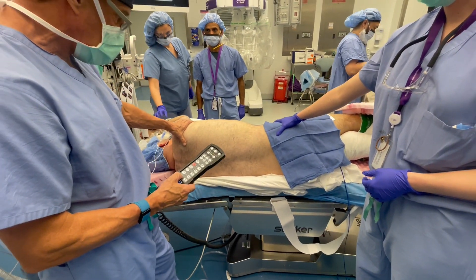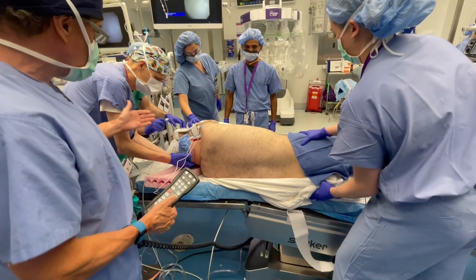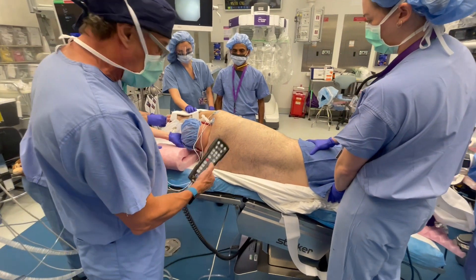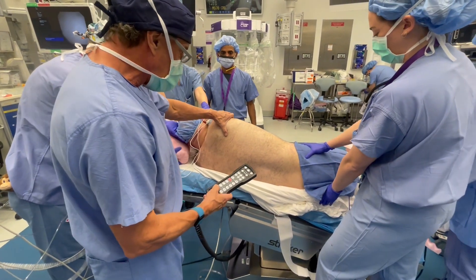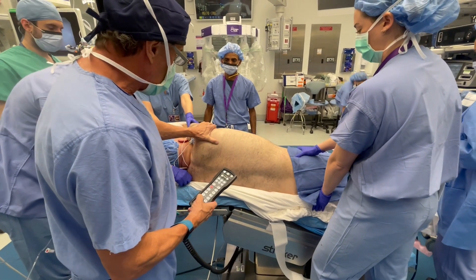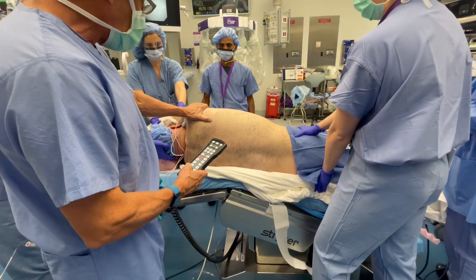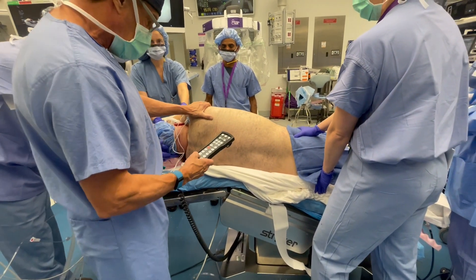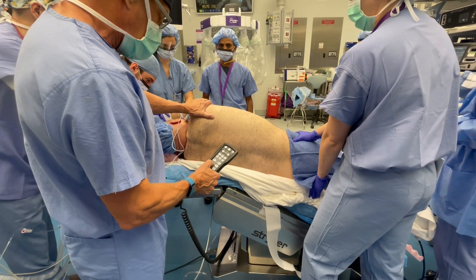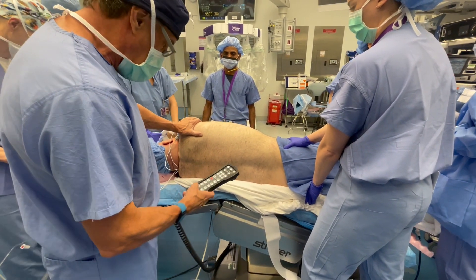We'll need two razors for this gentleman. Now you go reverse, because the last thing you want is your anesthesiologist, your teammate, to be working down by their knees. So you bring this up second, and you break them again. You want this not parallel to the floor, but a little bit of an angle. The reason for that is you don't want the right upper lobe or the left upper lobe flopping down on you. So you want a little bit of an angle like this, with a maximum break.